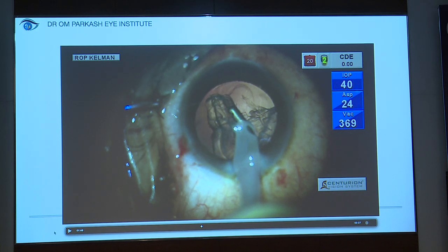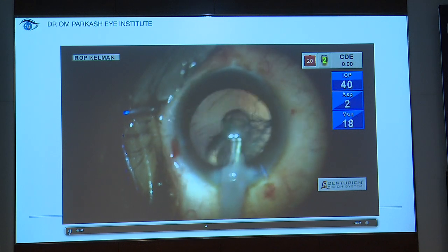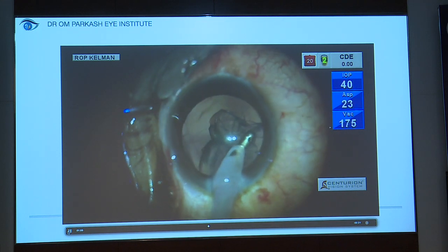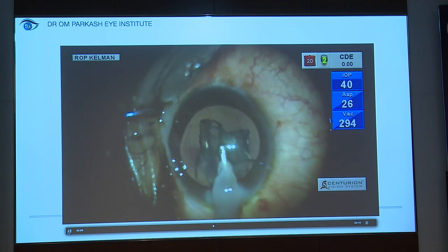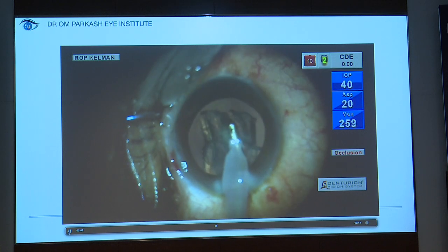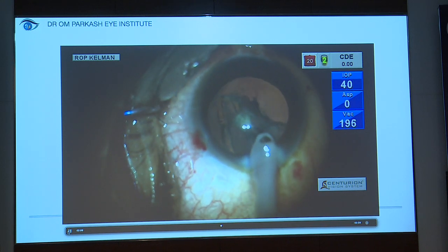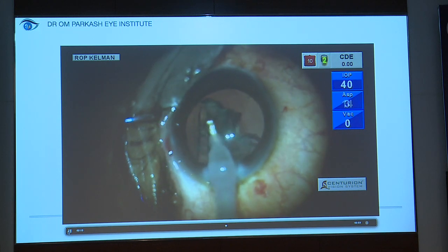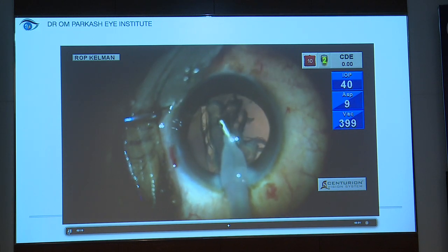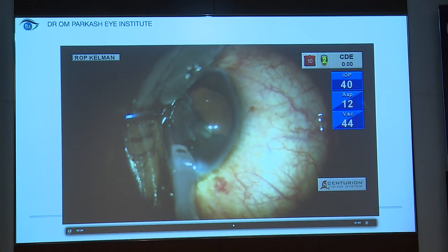So now what is this epinuclear shield? I'm going to take it, I'm going to disengage it, and I'm going to dislodge it from its peripheral attachments, and I'm going to keep it there. I'm not going to aspirate it whatsoever. You will find that I'm dislodging it, and after dislodging it, I'm leaving it there. And then I'm just trying to take out the subincisional one. Mark my words, till this point of time, the open posterior capsule has not been exposed to any direct fluidics whatsoever. So I'm using epinucleus to my advantage by creating an epinuclear shield.